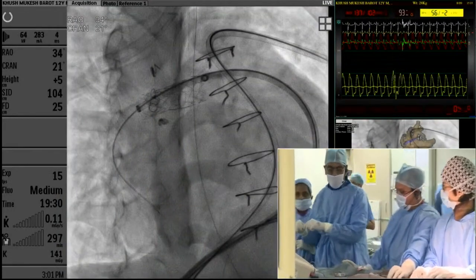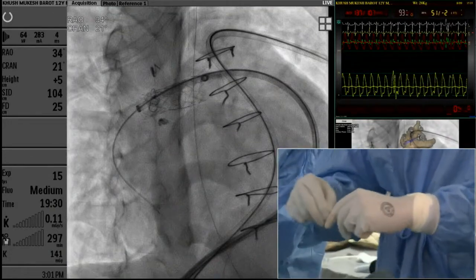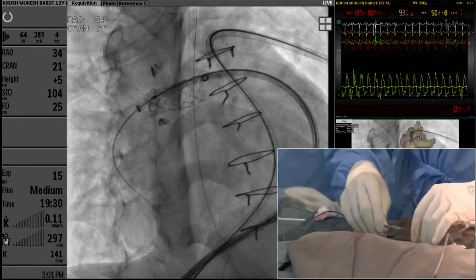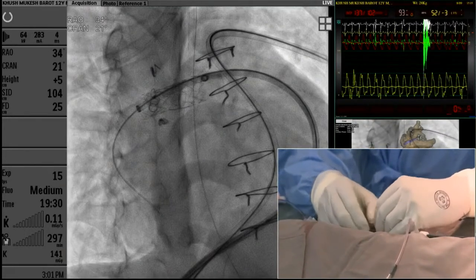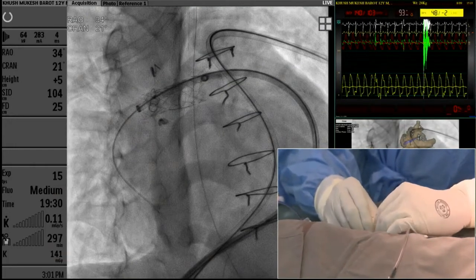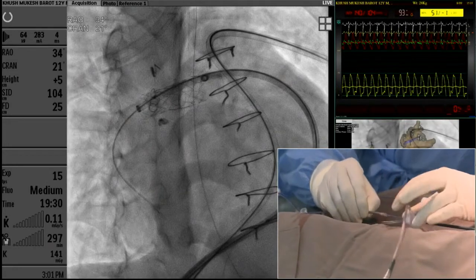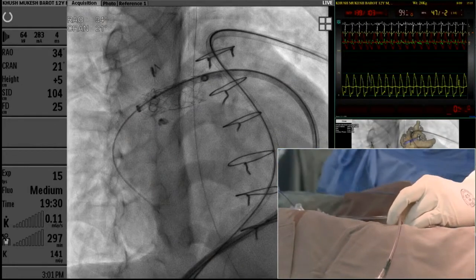This stent comes as 18, 28, 38, 48, 58, like that. After 18, the next is 28. That is the length of the stent. The diameter is up to 18, depending on the balloon that you mount. It's a non-foreshortening stent, so it will remain the same 28 at all the diameters. Fix the wire, keep it straight, keep the balloon straight and fix.